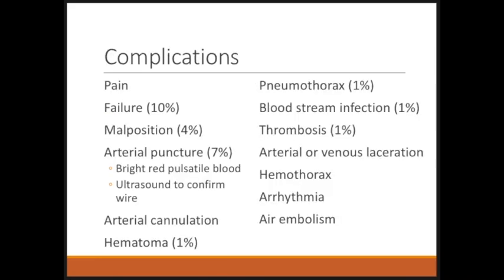Pain is a common complication, so be sure to use a liberal amount of lidocaine prior to the procedure for the patient. Failure happens, especially higher when you're first learning the technique versus more experienced practitioners. It also varies by site selection, so subclavian will be the hardest. Arterial puncture is an important one.